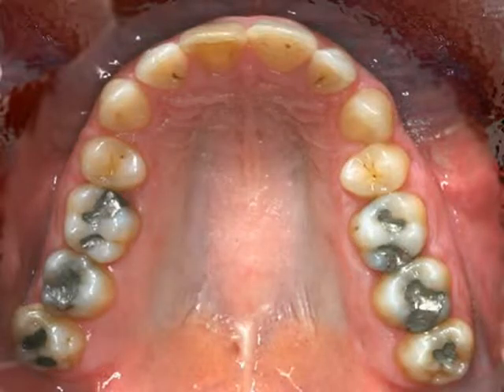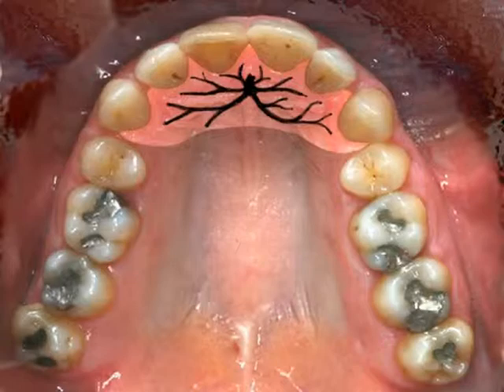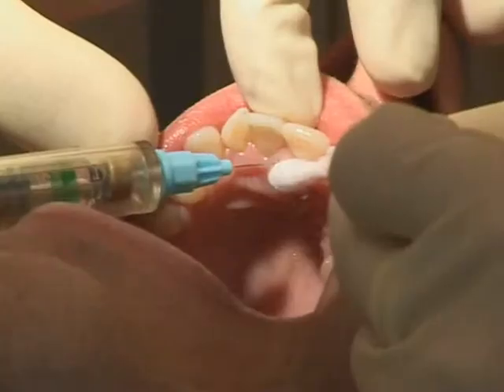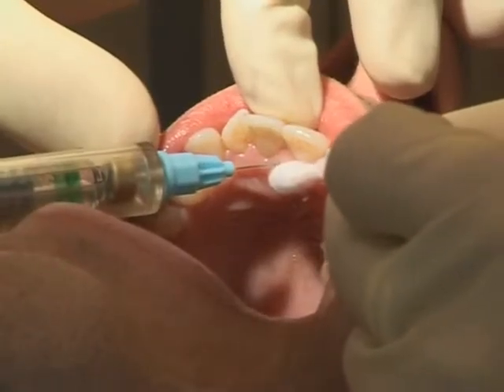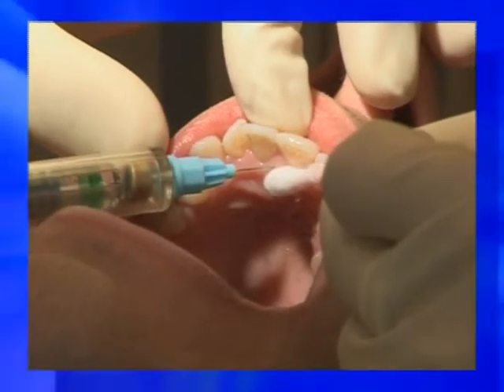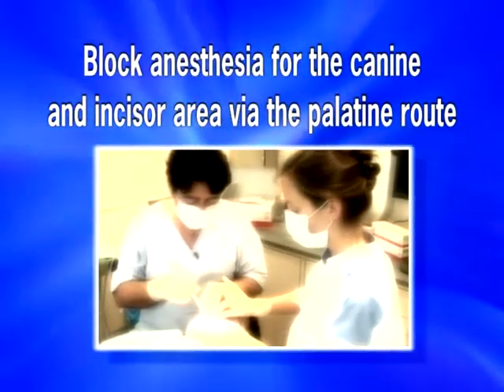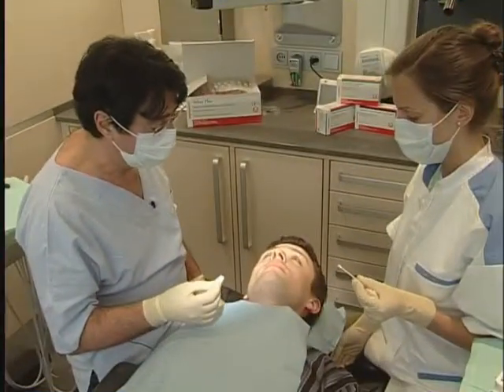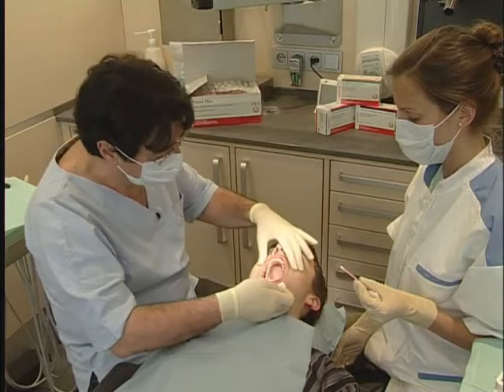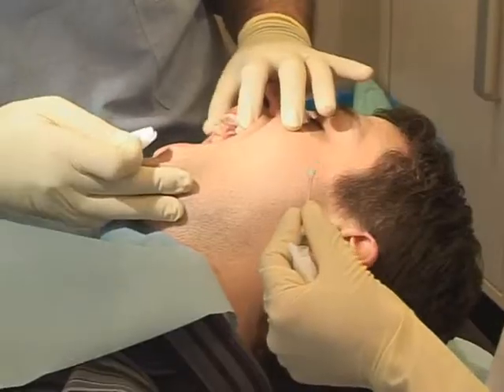The needle prick and the injection are always painful in the incisor and canine area, even if you use a surface anesthetic and apply pressure with a cotton stick. Block anesthesia for the canine and incisor area via the palatine route has been popular in recent years due to the development of electronic injection equipment.